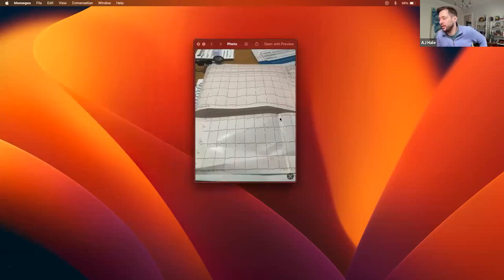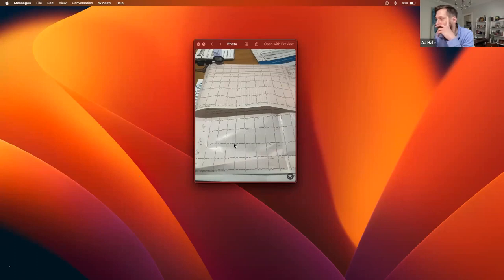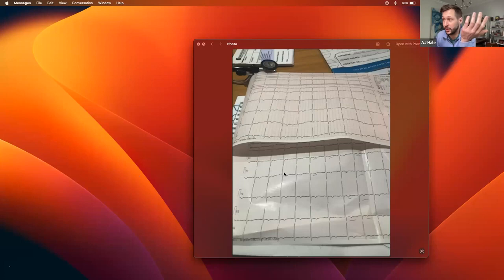Sorry to get sidetracked, but I think we have a little bit of time. Can everyone see this right here? Yes, we can see it. Okay, sorry, I thought I had ended the conversation for a second. So this is the 12 lead you're talking about. We have a PR interval. I don't know if I can zoom in any more, but let's see. Oh, we can. So we have a good PR interval. We don't have a long conduction timing. We have a narrow QRS, so there's really no indication for any kind of CRT or anything like that.